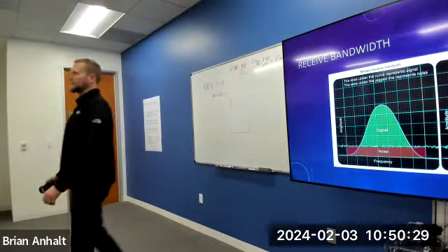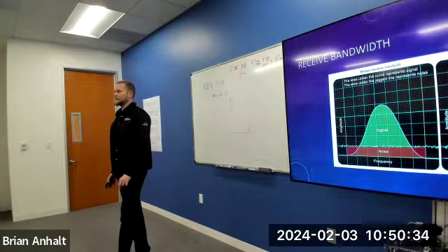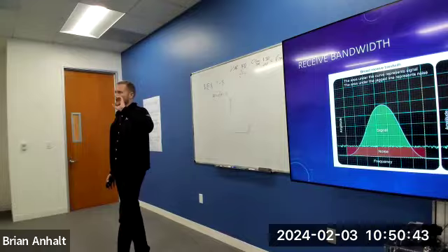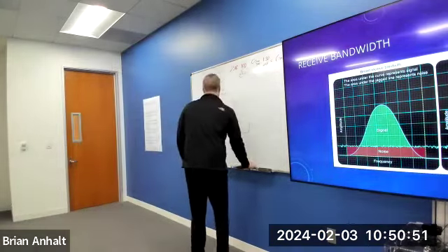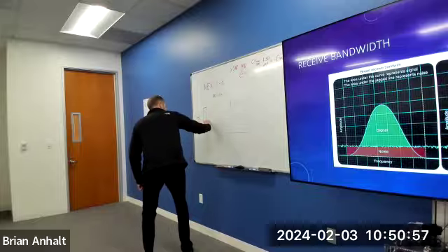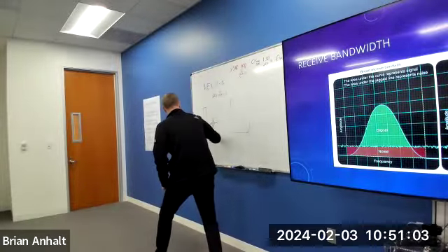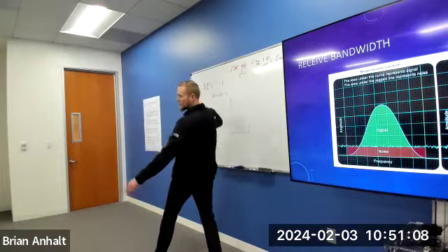Yes. Do we use bandwidth for spin echoes? Yes, you use bandwidth on every type of sequence. Good question, because you're wondering where the gradients are coming in. Gradients are always there. The spin echo pulse sequence diagram I showed you is oversimplified. There are gradients going off for spatial localization the entire time. And we know now that they're here, so it would look more like this. Since you asked the question, we have excitation, refocusing, signal collecting. At the same time, we're turning on a gradient while that echo is being collected. That gradient being turned on gives us our bandwidth.